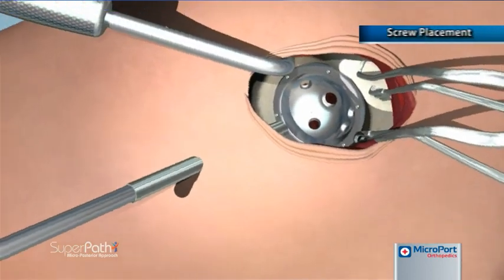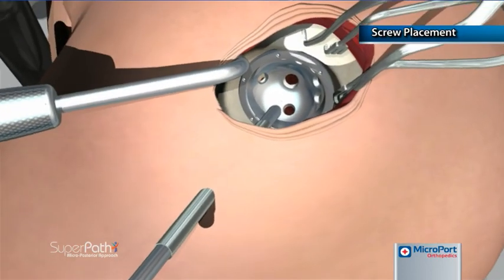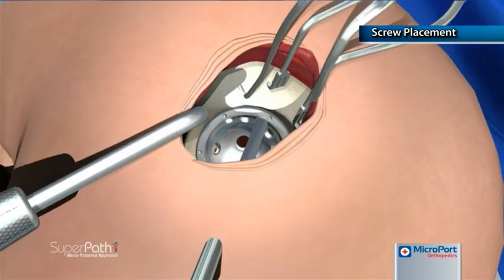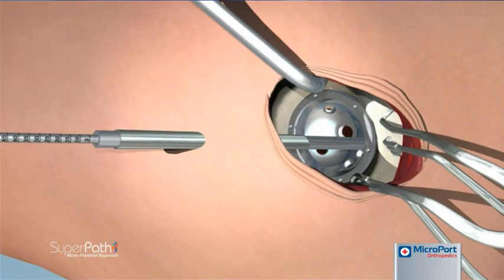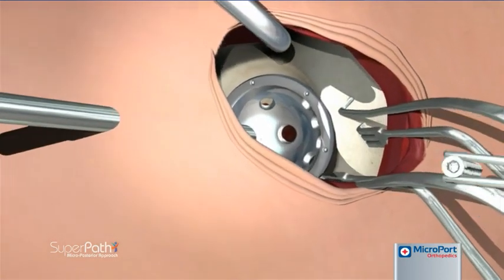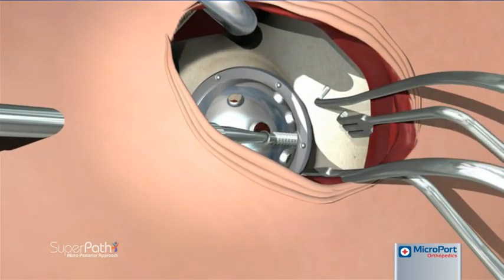Pilot holes for acetabular screws are created by inserting the drill tube through the cannula until it engages the screw hole. The screw drill is then passed through the long drill tube, and using the measurement markings on the end of the screw drill, drilling is carried out to the desired depth. The straight screwdriver is passed through the cannula to engage and tighten the acetabular screws.